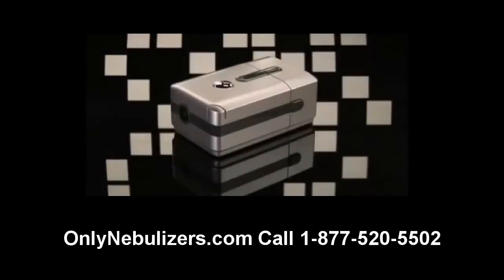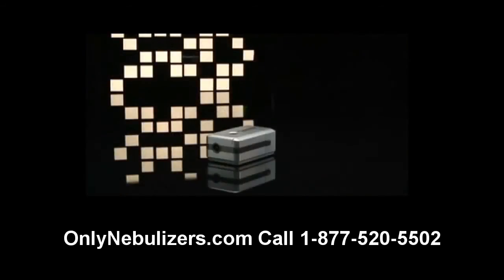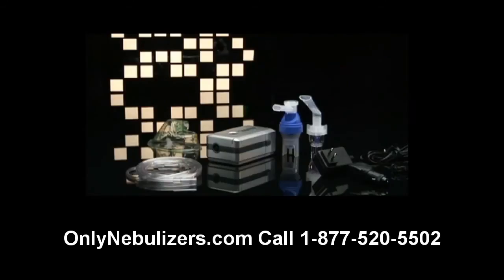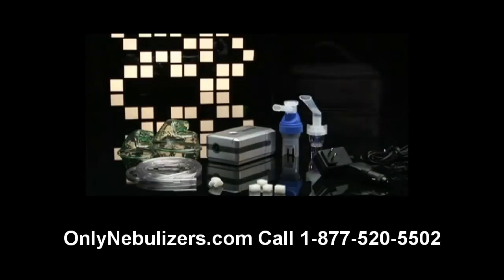The DeVilbiss Traveler Portable Compressor is very easy to use and includes the following: compressor, AC power adapter, DC power adapter, disposable nebulizer and/or reusable nebulizer with tubing, adult and pediatric aerosol masks, nebulizer holder adapter bracket, replacement filters, carrying case, and battery connection cover.